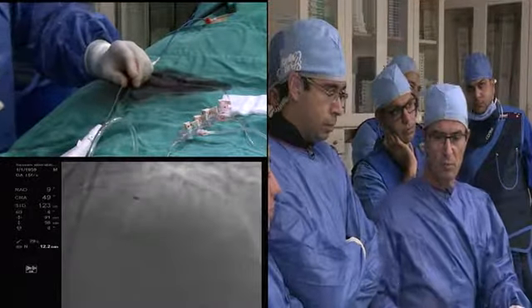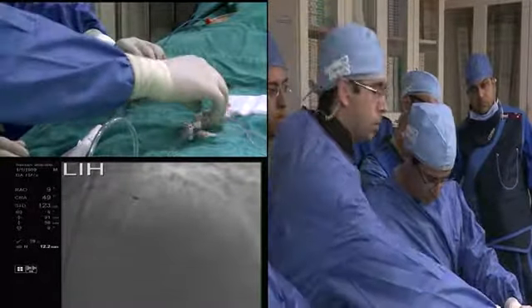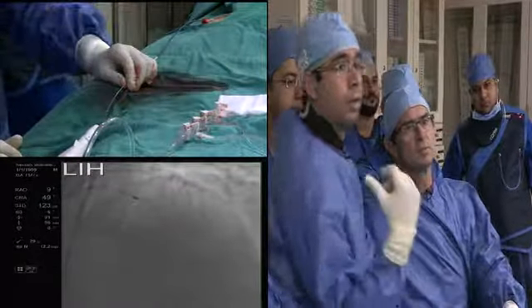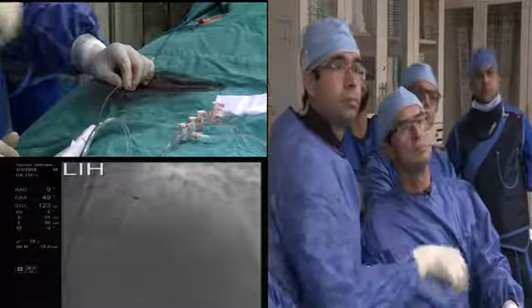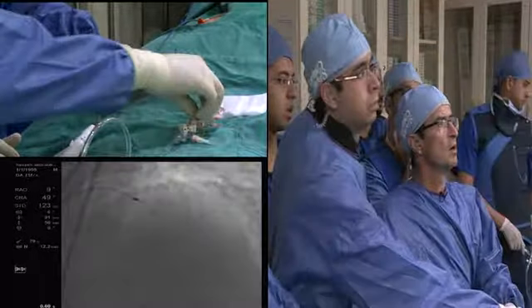Okay, and then we could do an angio now. Are you ready for angio? Yeah. How is the pressure? Pressure is low. Can we fill the patient? Fluids. Okay, fluid.